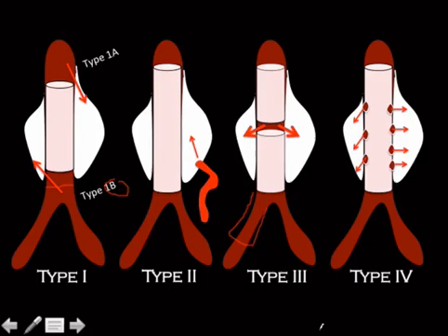And type 4 is the pore, for pore, and this is really historical, but the material that they used to make these things out of had some element of porosity, and they would leak.